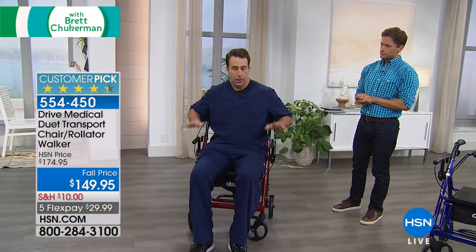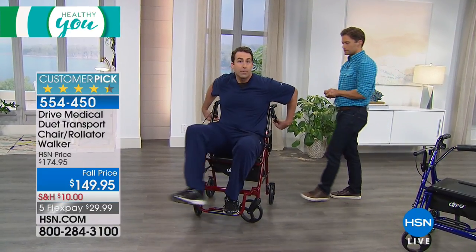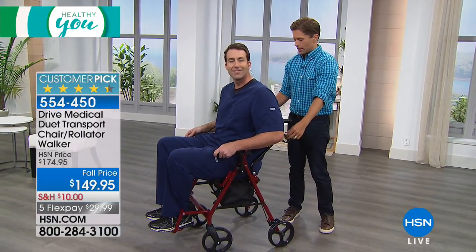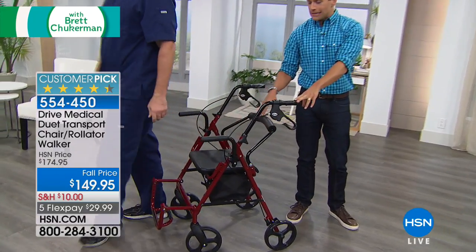Sometimes we need to convert from a rolling walker to a transport chair. All I need to do is take the backrest out here, reverse it just like this — now it's reversed. I can sit down and take a comfortable seat in my Duet, just like this — I have armrests. The wheels are still locked and all I need to do is pull out my footrest and let Brett push me. Most wheelchairs are big, large, only go in one direction — very difficult to maneuver, incredibly heavy and bulky. Now you have the opportunity to be the support system when you need to be. How difficult is that to push? Not hard at all.